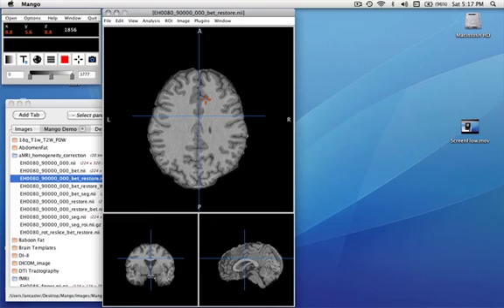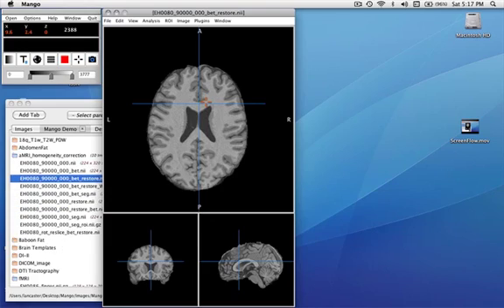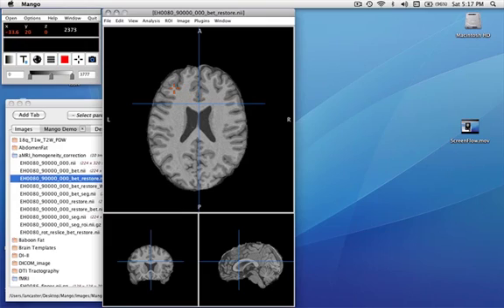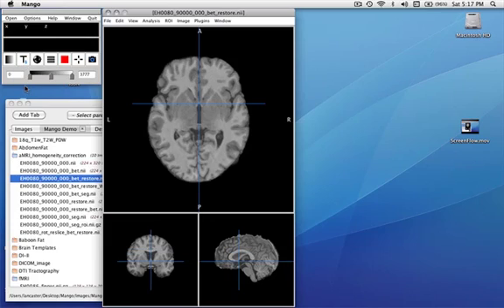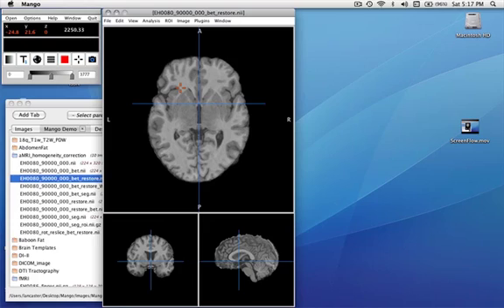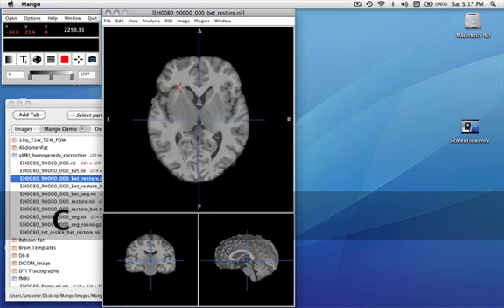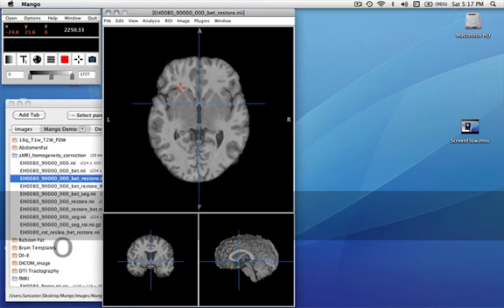The origin can be located by pressing the O key, and this is the current origin for this image. I can make the image line up at this origin in Talairach space. I'd previously done this and loaded the transform, so we'll choose this transform, and now we see that the origin, when we click it, goes to the anterior commissure. If you click C, it goes to the center of the array space and O back to origin.